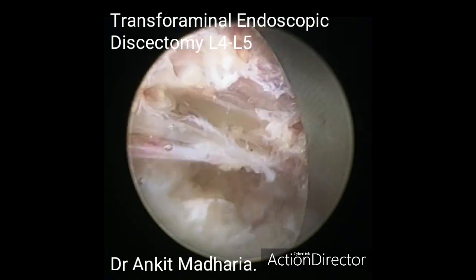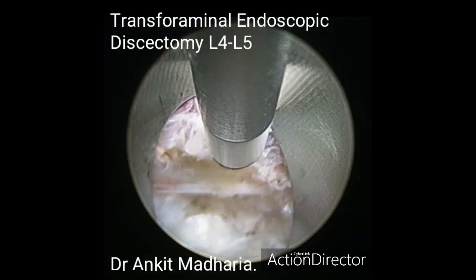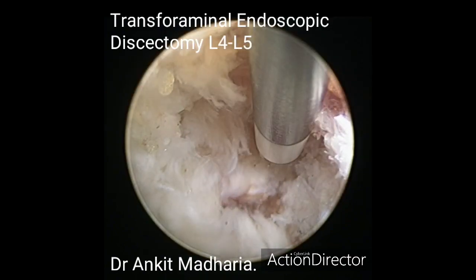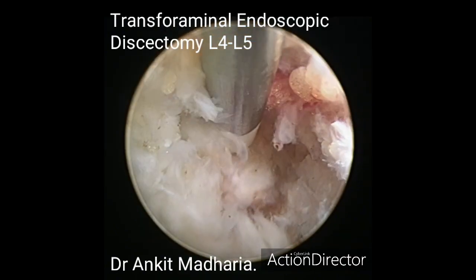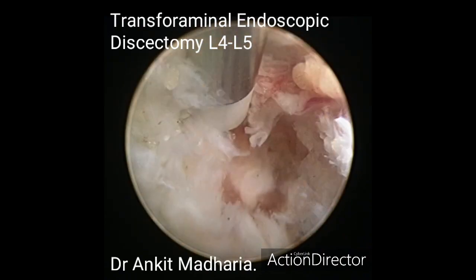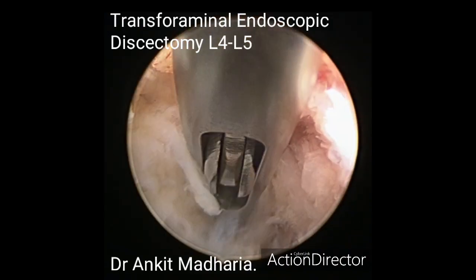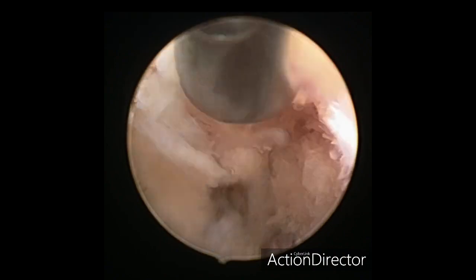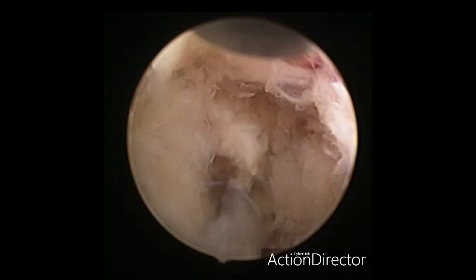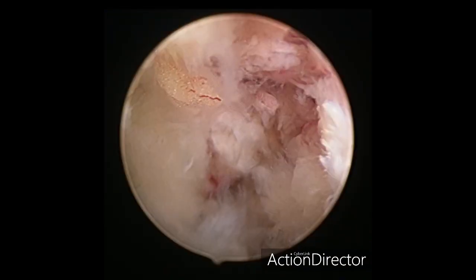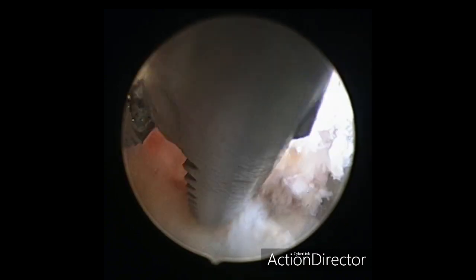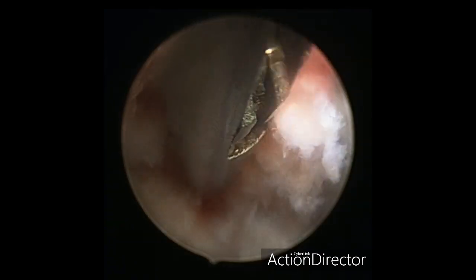After finishing the annulotomy, we can see a central disc fragment which is trapped in the annular fibers and cannot be mobilized easily. The nuclear trapped fragment is removed using a grasper. A flexible grasper is finally used to remove the central and paracentral part of the disc.